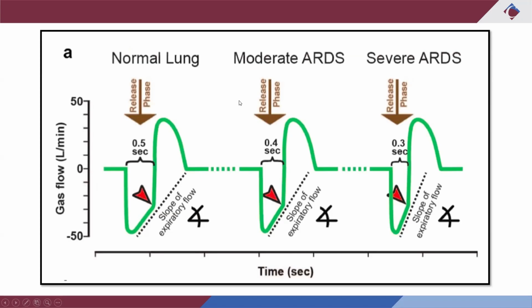Now, as the lung gets stiffer and starts migrating into ARDS, say they go from stage 1 to stage 2, the lung gets stiffer. By shortening the time low, you redo that angle, because the angle is going to change. If it stayed at 0.5, it would get flatter, and you want the lung to empty quicker, so you shorten the time low. It's also based on time constants.